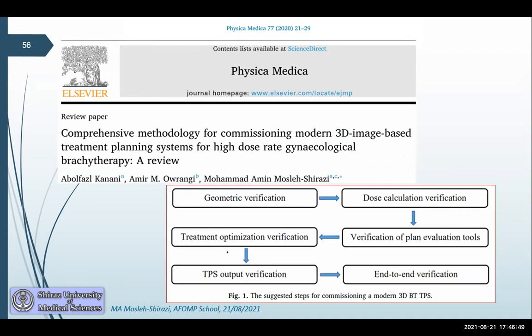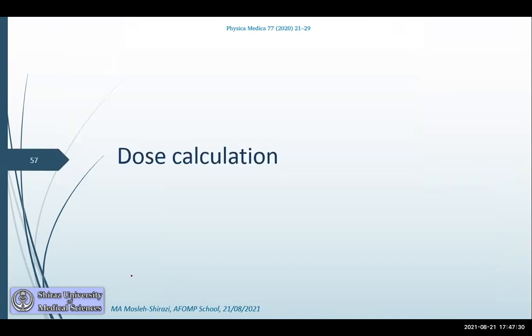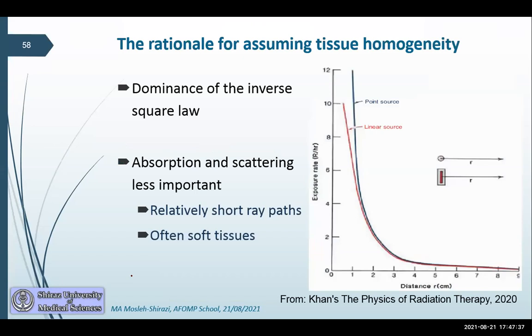Nowadays, modern 3D treatment planning systems are very complex, and there are lots of features and lots of things that need to be checked, really. In this fairly recent review paper from our group, we proposed a comprehensive template for commissioning this type of TPS that goes through all of the aspects of what a TPS does and suggests how to actually commission it.